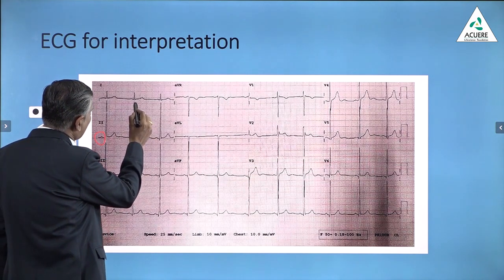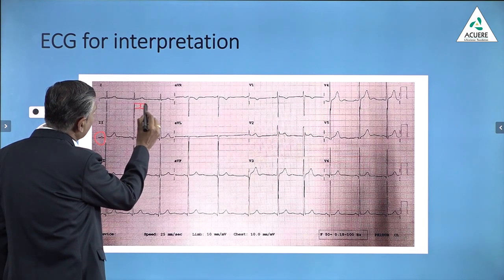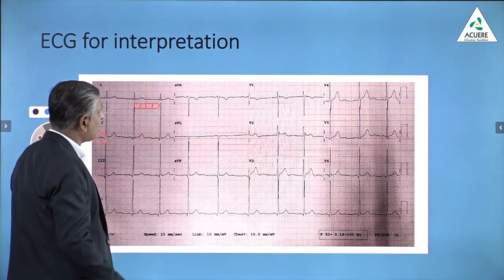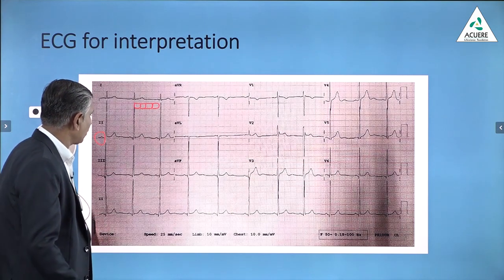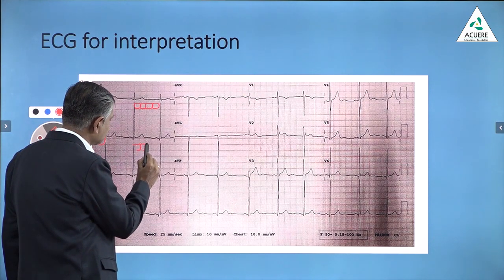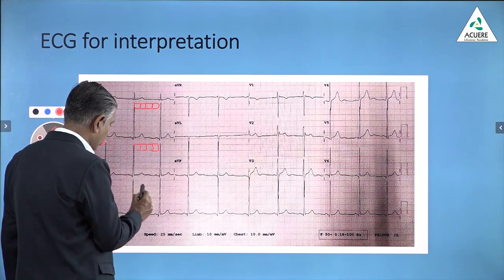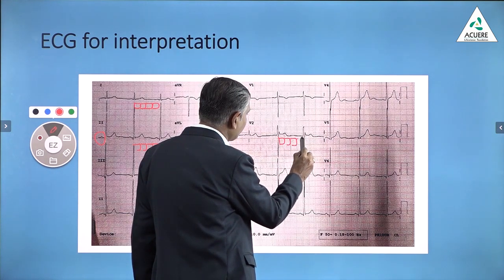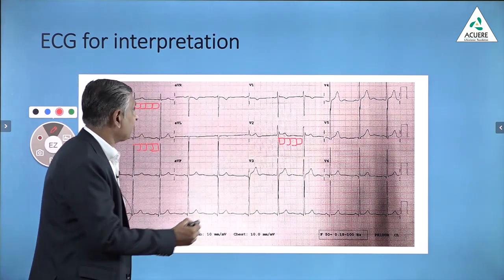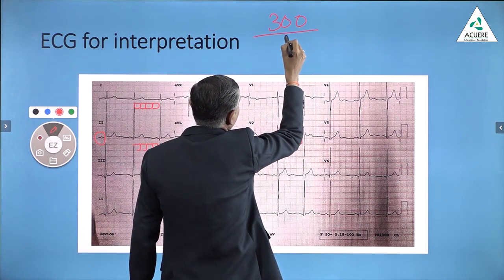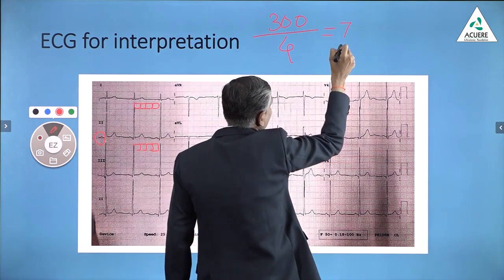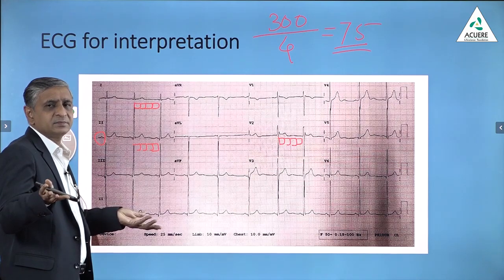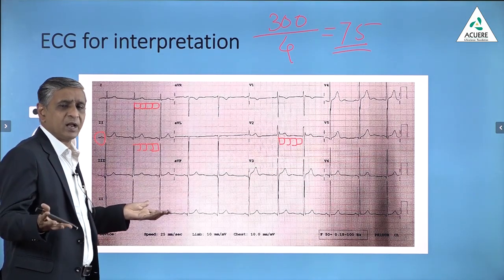The second thing is that you have to count the number of large squares in between the two R waves — that is what we call the R-R interval. It is around 4. Then our equation is 300 divided by 4, which is equal to 75. And that's why the heart rate of this ECG is a little more than 75. You can call it a normal heart rate.